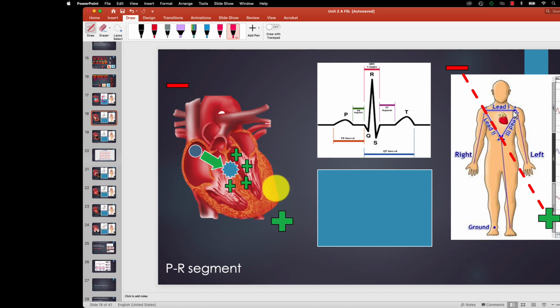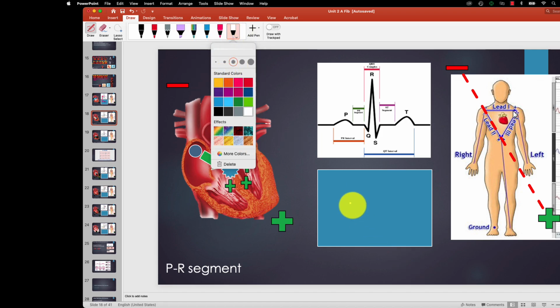It's static. Okay. So now when it's static and there's been no further firing towards the positive or towards the negative electrode, then what we get is this section of no deflection. And it's going to look like, let's get this one.